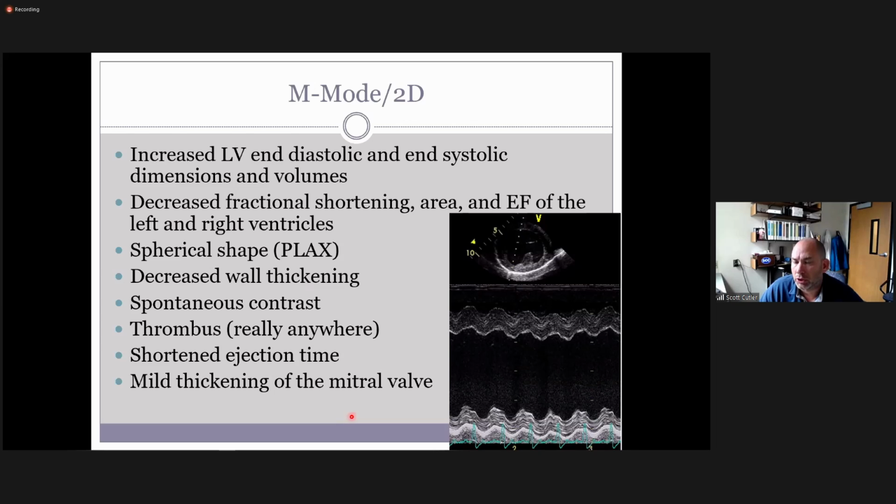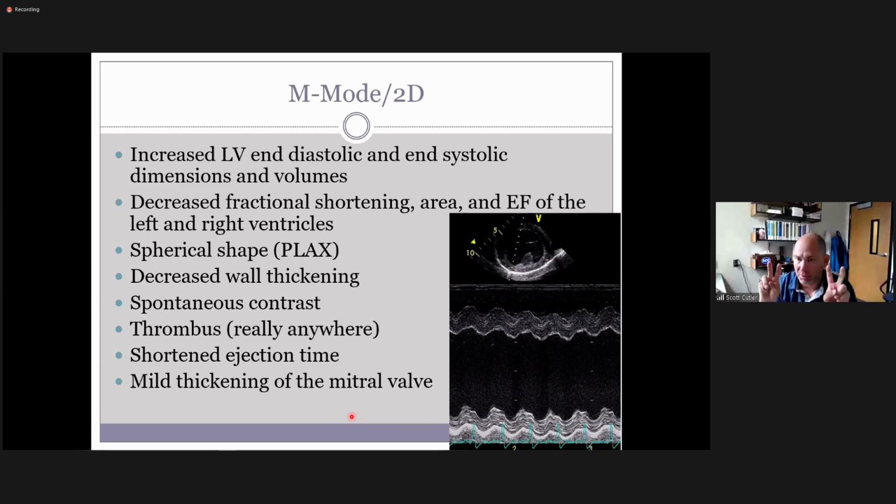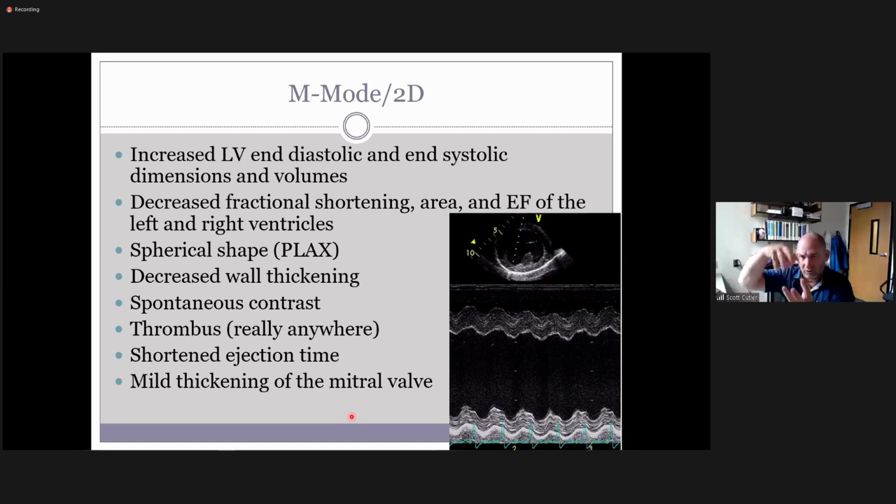Yeah, so when you're looking at the flow come in, we know that the flow kind of comes in, goes out, and it's usually pretty black, especially on our older systems. You may have seen this when you're doing venous exams. You'll actually see the flow coming back and forth. It looks like 2D information. It's not artifactual. You'll see it actually moving back and forth. So when the ejection fraction gets poor, you'll actually see the blood swirling with little speckles on that flow. That is the spontaneous contrast. And you've got those stacks of red blood cells coming together causing bigger reflectors.